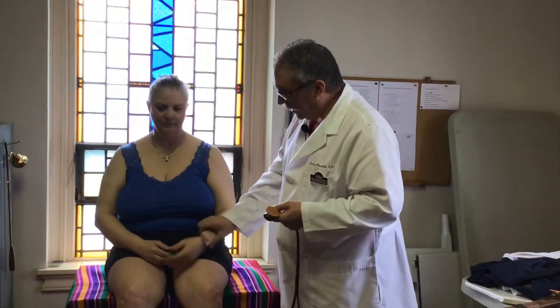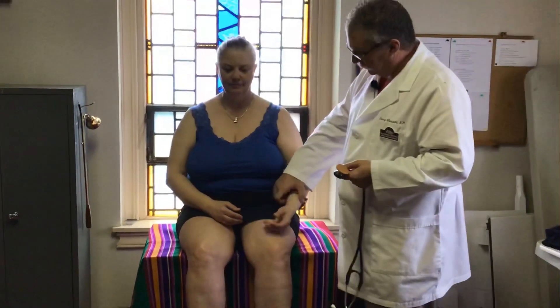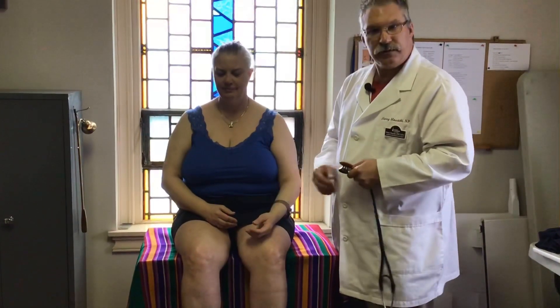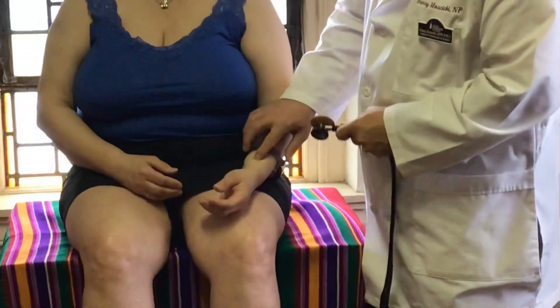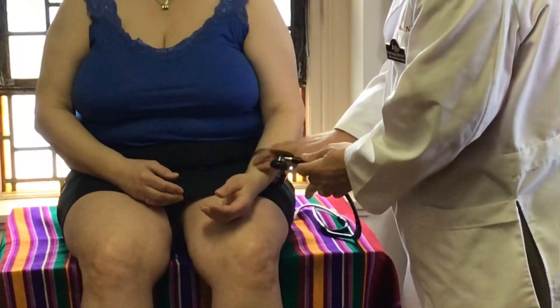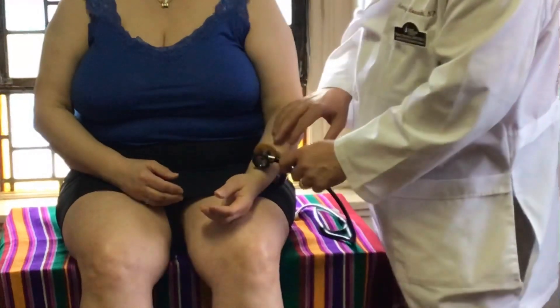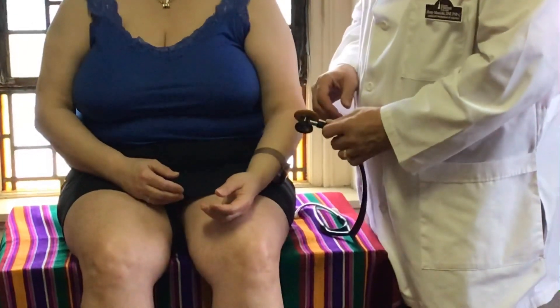For the brachioradialis, there are two methods. First, have the patient take off their watch and rest their arm on their lap. Find the distal radius and go two finger breadths above — that's your landmark. Strike there and look for the fingers to move. She might withdraw a little bit.